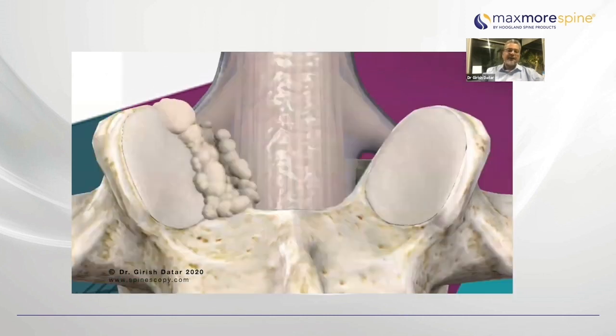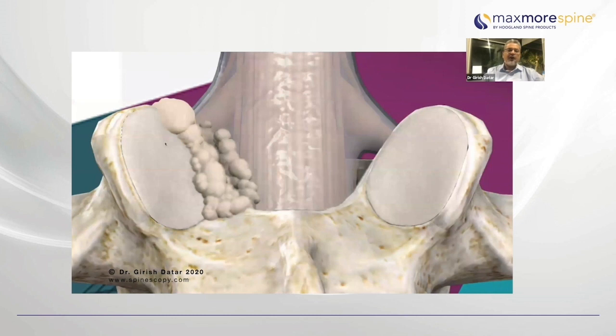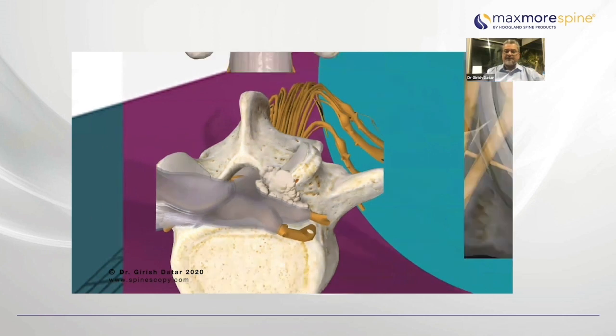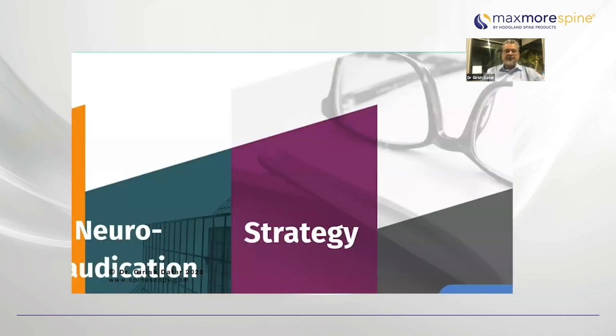So this is the kind of osteophytic growth, and this is all around the axilla. So there is nothing happening in the central part. You don't see much osteophytes here. All the osteophytes are located more laterally. And that brings us to an understanding that stenosis is probably more a lateral pathology than a central pathology. So this is all part of the stenotic pathology.